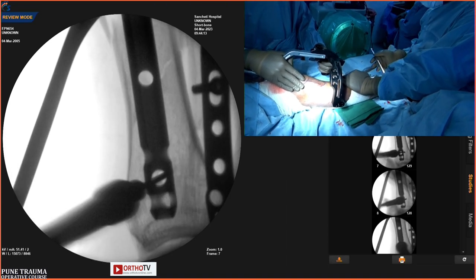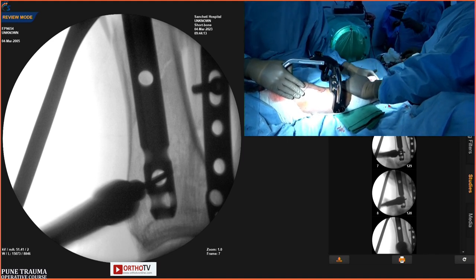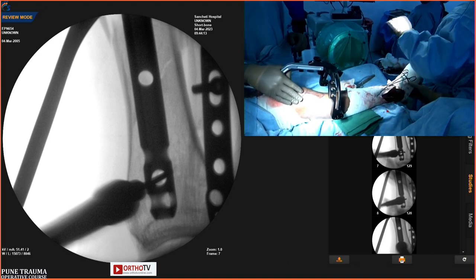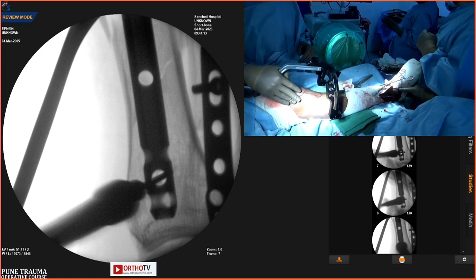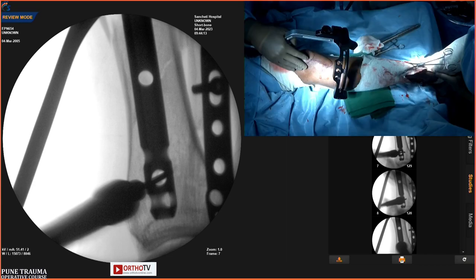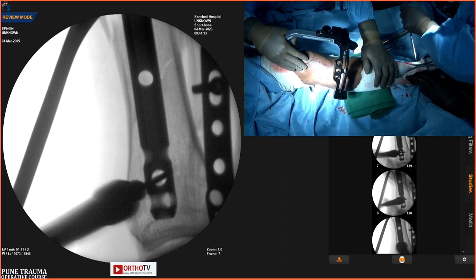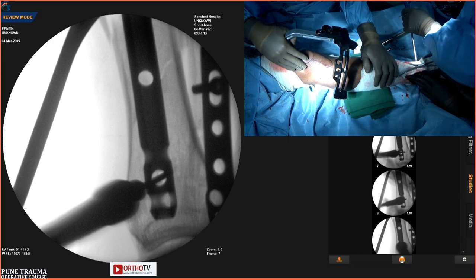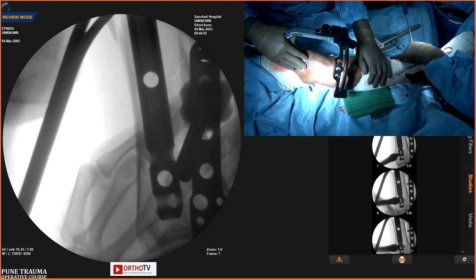Why did you insist on really doing the distal locking first in this situation? No, it is not required, but it's an easier thing to do. You mentioned that you must first do the distal locking. I feel in this sort of a case, it is not important. But in a transverse fracture, when you want to reduce this gap, then it is very, very important. So in a distal tibia, I have made it a habit of doing the distal locking first, because the stability of the distal fragment is much more important, and proximal locking is just to complete the procedure. Stability of the distal fragment is very, very important here.